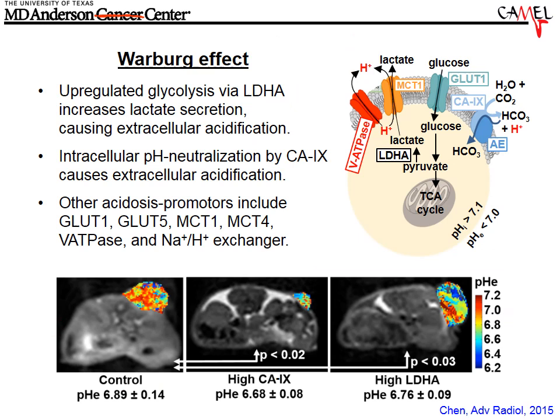So one of those properties is to measure tumor pH, particularly the pH in the extracellular tumor microenvironment. The pH in this environment is known to be acidic, less than pH 7, while the internal pH is often 7.1 or higher. And this is caused by the Warburg effect, the upregulation of glycolysis in tumors that drives the production of lactic acid, which is then secreted, or a compensatory mechanism causes neutralization of the internal pH, and that causes extracellular pH to drop as well. Extracellular acid is produced.